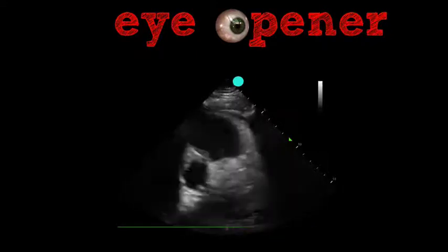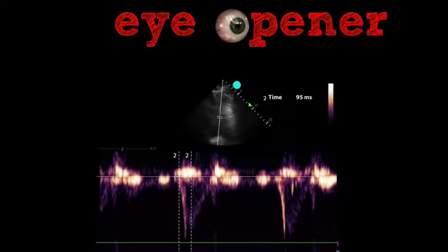So I was a little disappointed I couldn't find a clot, but while I was there, I measured a pulmonary artery acceleration time. That's simply putting pulsed wave in the pulmonary artery just beyond that pulmonic valve and measuring the time that it takes for that pulmonary acceleration waveform to go from baseline to its peak acceleration or peak velocity. And so in this case, it was 95 milliseconds, which is short compared to normal.